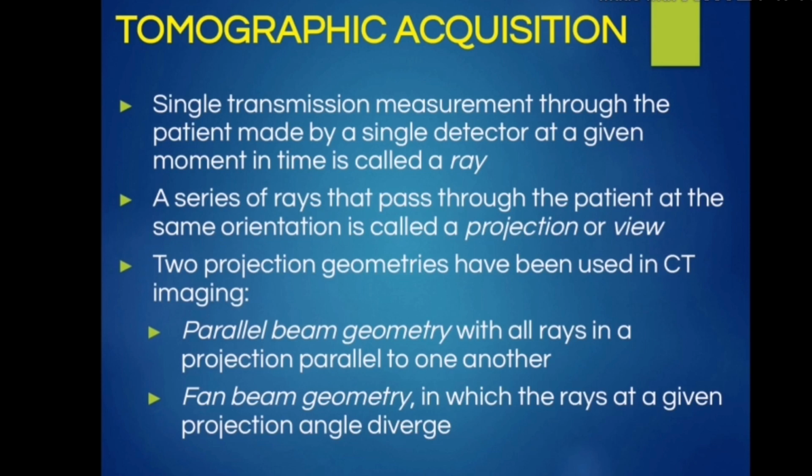First, parallel beam geometry, with all rays in a projection parallel to one another. Second, a fan beam geometry, in which the rays at a given projection angle diverge.